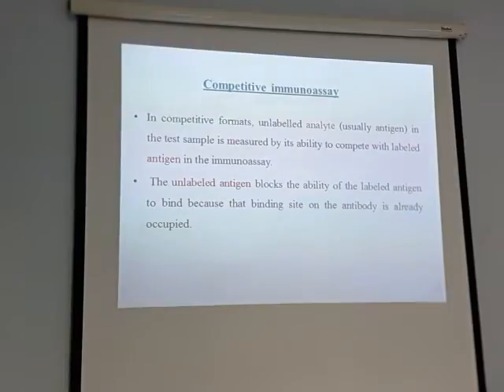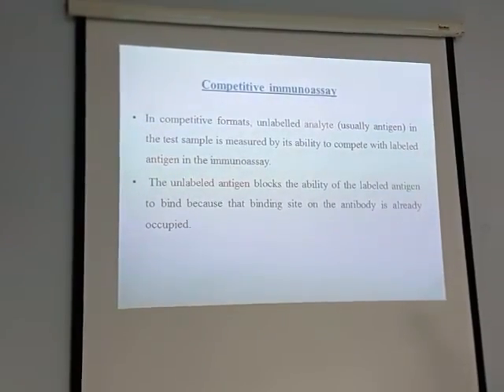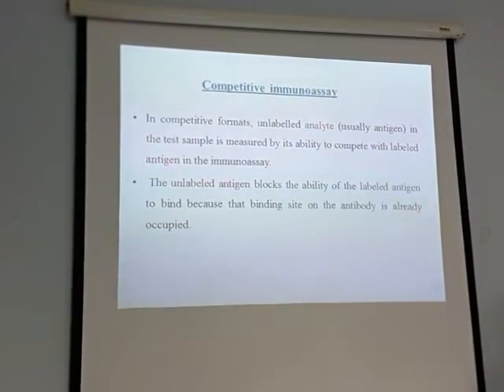When we mix them together, the unlabeled antigen, meaning the antigen present in the sample, will go and bind to the antibody and block the chance for the labeled antigen. So this is called competition. One antibody, one labeled antigen and one unlabeled antigen, so both compete for the antibody.